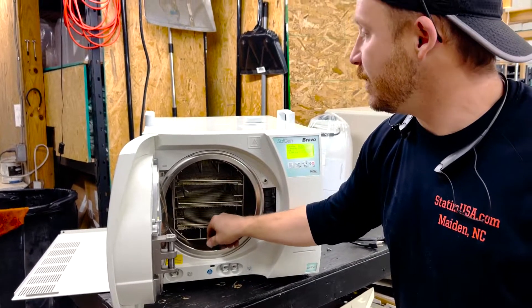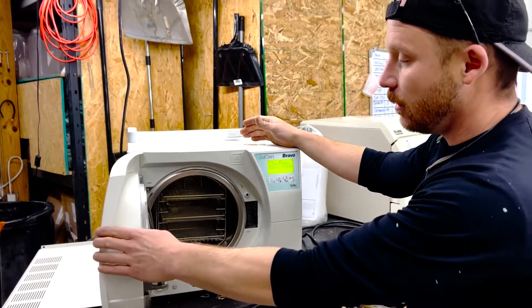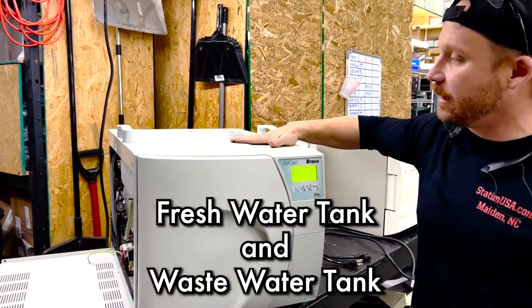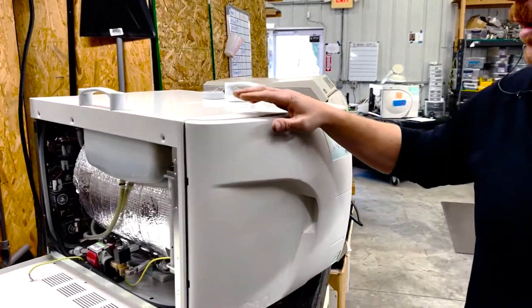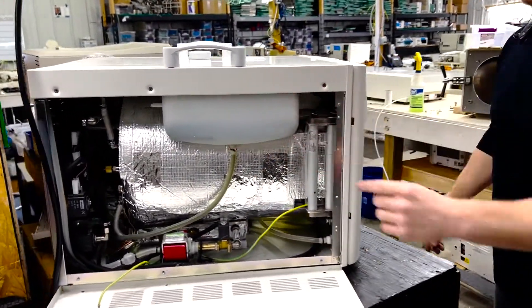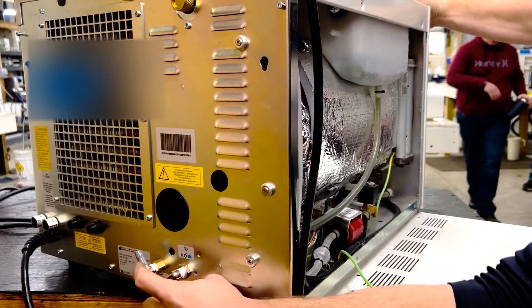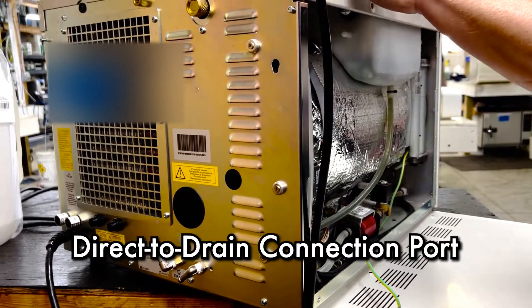These units should be drained. If not in use, they should be drained weekly. They have a fresh water tank here and then a waste water tank here. If you hook it up direct to drain — which if you go around to the back of the unit, there are two barbs here. If you hook up this one with an elbow, you can hook that direct to drain so that you'll never have to drain the reservoir.